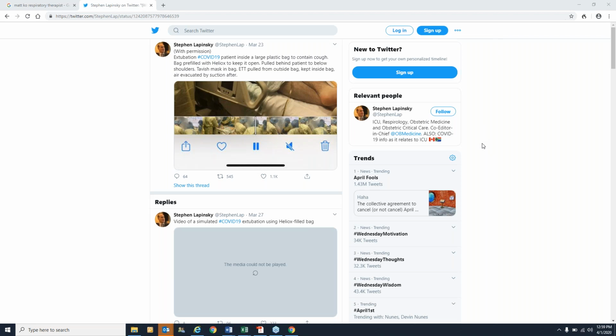Not to interrupt you, but I can tell you in Hamilton, we are stopping CPR to do the intubation. It's in our policy. I think we are too in Barrie. That helps. Okay, so this is actually just to increase first pass for the intubation, not necessarily aerosolizing COVID with the CPR, correct? It doesn't really specify, but.